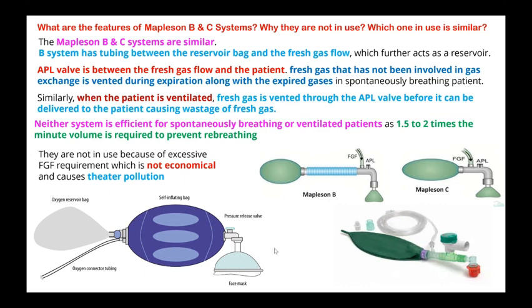So wherever you have a patient who is very deeply hypoxic and needs a higher percentage of oxygen, you have to have an oxygen reservoir bag attached to the Ambu bag. On the contrary, a patient who has just been resuscitated from a respiratory arrest, who has not become very badly hypoxemic, you can resuscitate with room air alone or with supplementation with oxygen tubing just like this. So the percentage of oxygen delivered depends on the presence of the oxygen reservoir bag or the tubing that is attached to this Ambu bag.